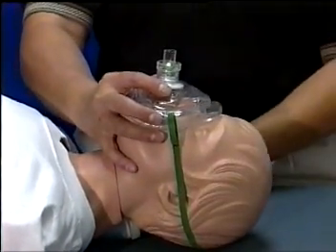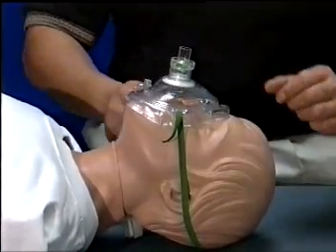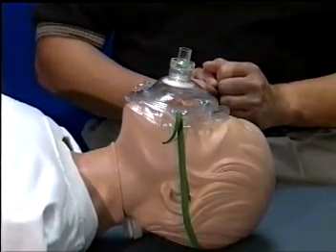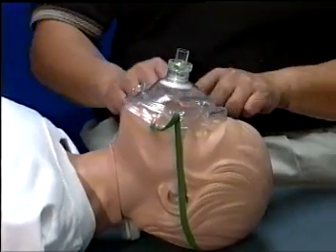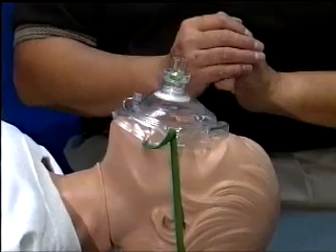The mask will form to the natural contours of the face to obtain a seal. A minimum hand pressure is required to obtain an effective seal, and the mask design allows for a superior seal with varying hand pressures of different rescuers.